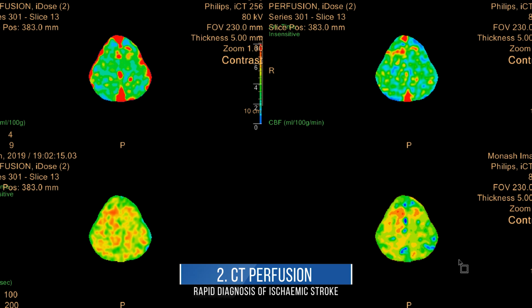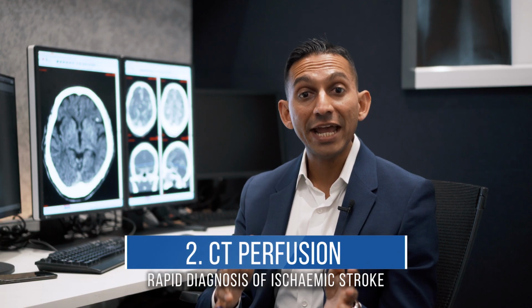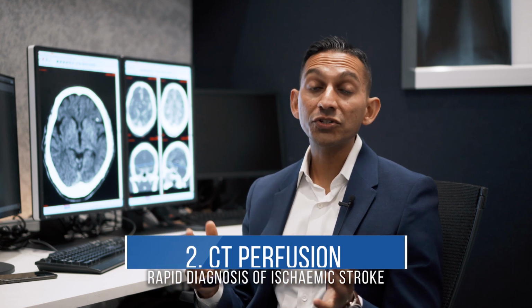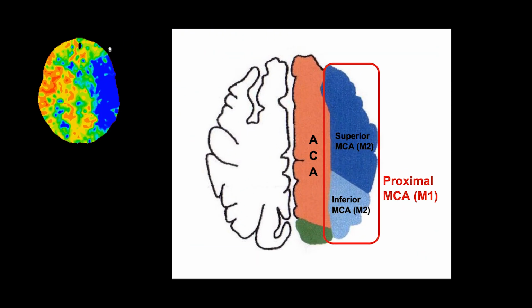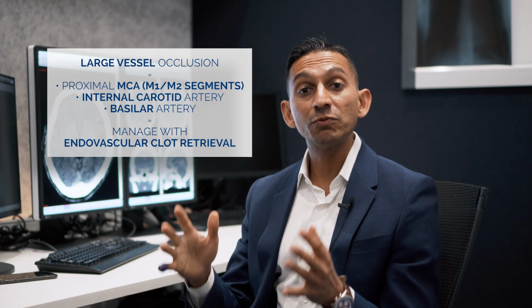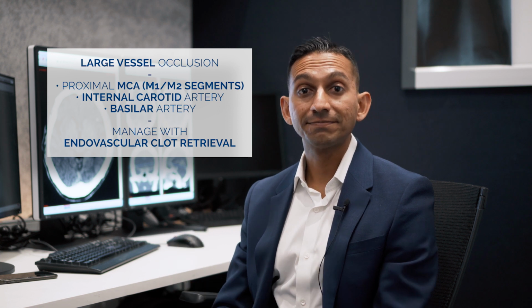Next is the CT perfusion. We use this to rapidly make the diagnosis of ischemic stroke. If there is a perfusion abnormality corresponding to a vascular territory that matches the patient's clinical symptoms, then the patient is having a stroke. We also use the CT perfusion to rapidly identify the site of vessel occlusion. This is based on the known vascular topography of the brain. This also helps stratify the management decision as patients with large vessel occlusions are treated with endovascular clot retrieval.